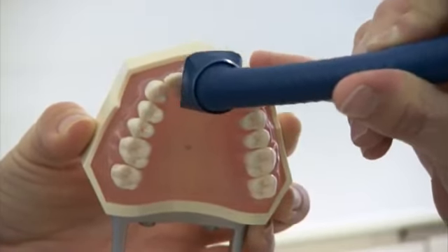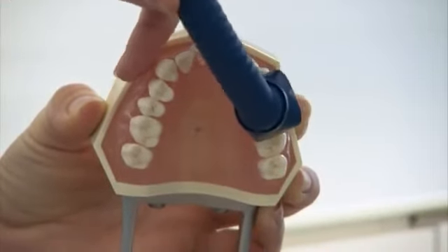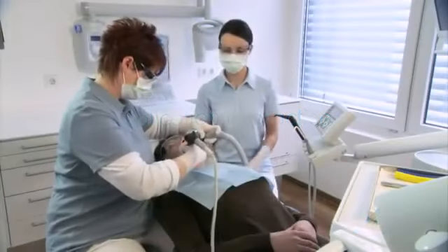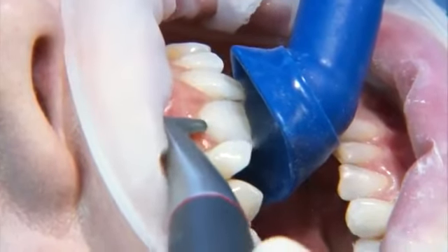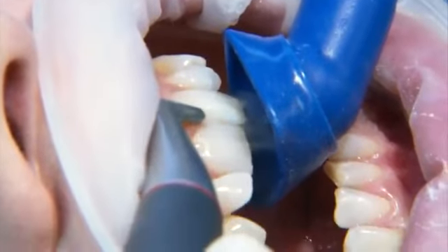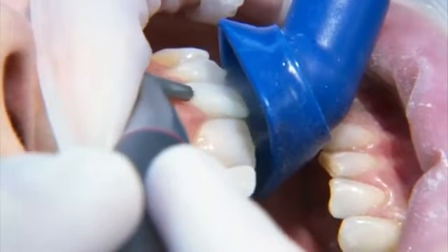It is helpful to practice using the prophylaxis cannula in the different suction positions on the tooth model. The prophylaxis cannula was designed specifically for the demands made for professional tooth cleaning. The distinct side of the shield perfectly channels the suction stream. The high aerosol uptake also makes the prophylaxis cannula ideal for treatment without assistance.